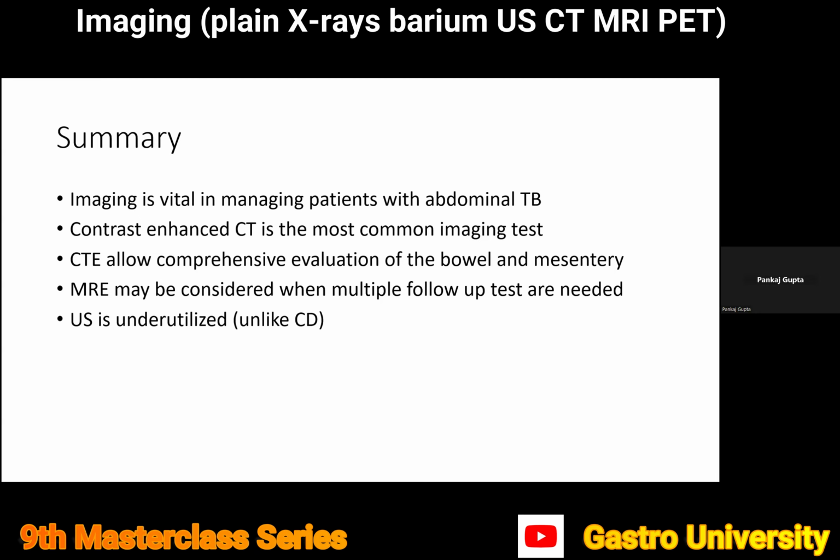I would like to compare it with Crohn's disease. European countries are using ultrasound very frequently in patients with Crohn's disease. So we should also think about incorporating more of ultrasound in evaluation of patients with abdominal tuberculosis.